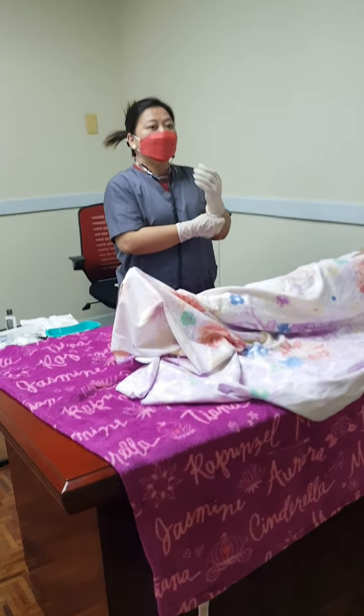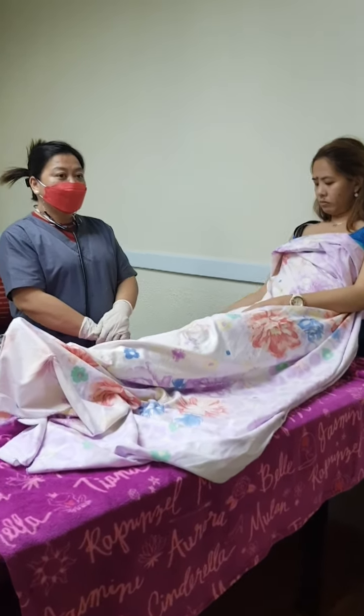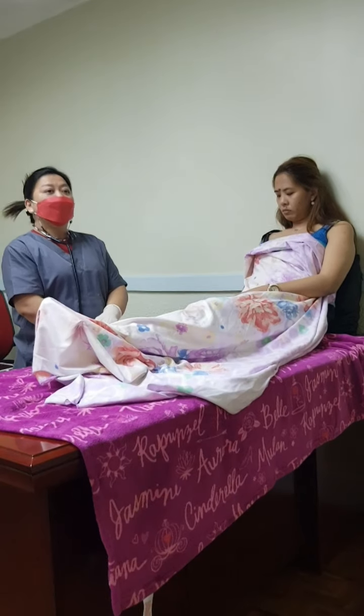Assist the client to high Fowler's position, or 45 degrees if unavailable, to maintain an upright position. Upright position is more natural for swallowing and protects against aspiration if the client should vomit.